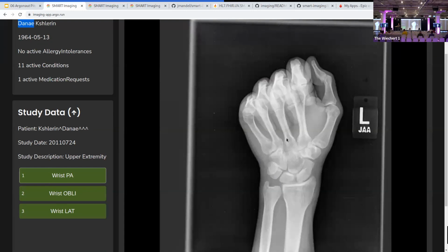But the number one capability that we want to make sure is enabled here is access to the full strength imaging files. And so I've used that as the basis for this demo, because even if that's all a server does, I want to make sure that we can show that working in the browser.